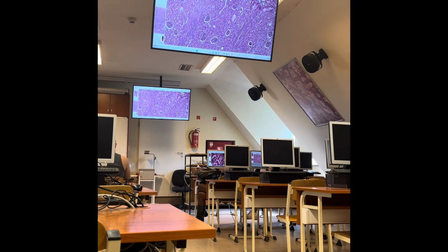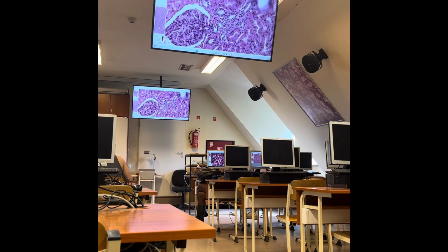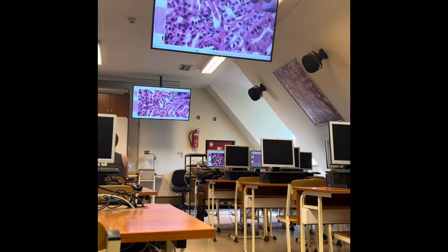And if you remember, the distal tubules return to their renal corpuscle, and at the vascular pole they form a special structure, something like this, what you can see here. What is that structure? Do you remember? Well, this is a spot-like structure.